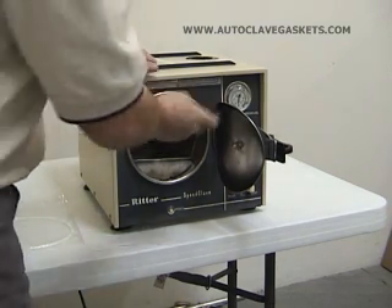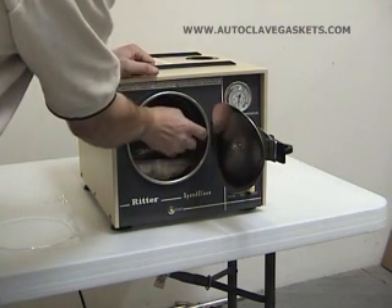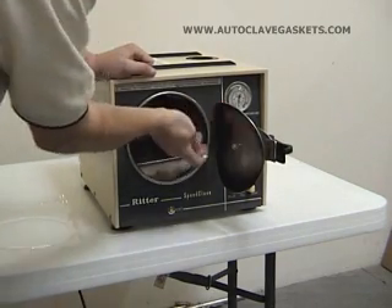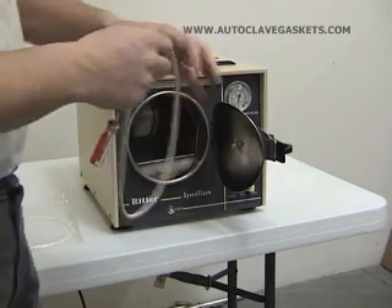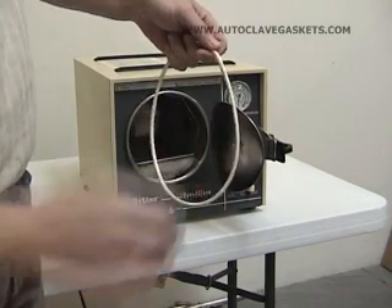If the gasket's already gone, you're really not going to damage it anyway. Just get it up under the lip in there and give it a little pry. Once you get a little corner out, you can just grab hold of the gasket and pull it straight down. You can see that one's pretty nasty — it's really ready to be replaced.